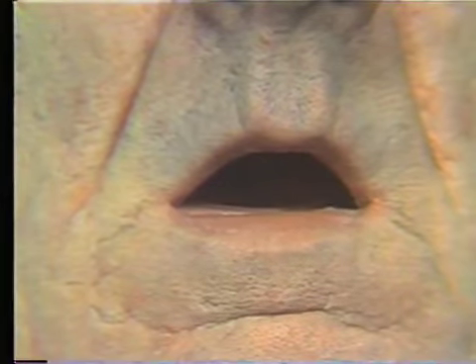Okay, it's well seated. Now, Mr. Monahan, just close and slightly open. And you see now, right at that point, with his mouth slightly open, we are right where we wanted to be, at a point where we are at or below the corner of the mouth with our wax occlusion rim.